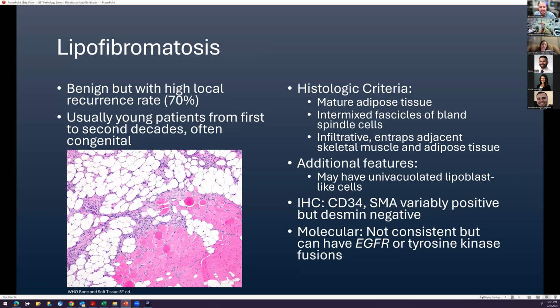They will generally be S100 positive, which we haven't talked about, but NTRK-rearranged tumors are often co-positive for S100. We'll talk about that in the undifferentiated tumors category later on. But yeah, so that's something that pops up occasionally.